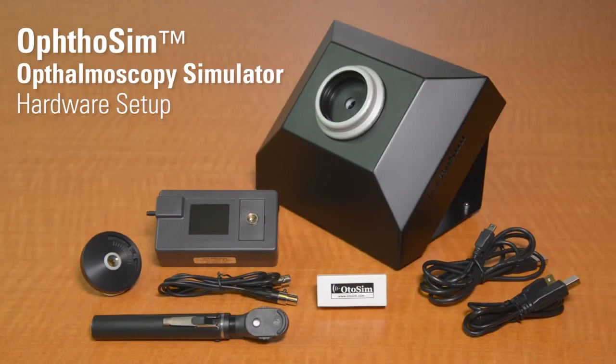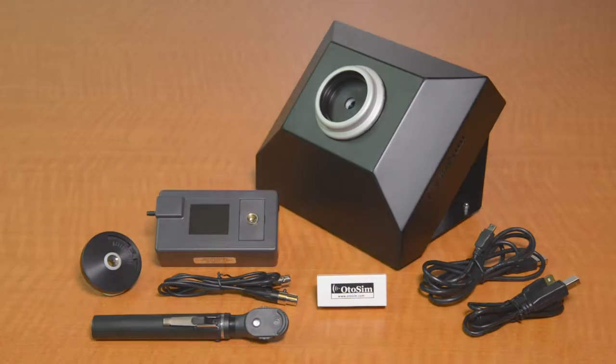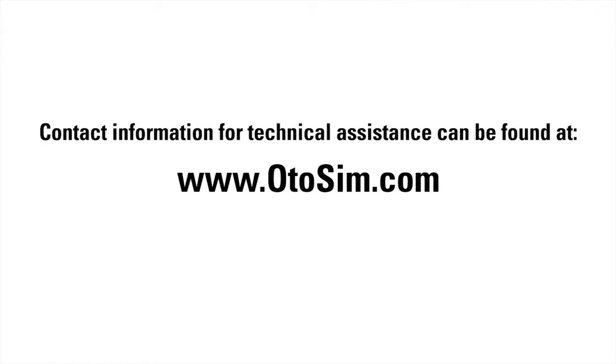This concludes the hardware setup for the ophthalmoscope simulator. If you need technical assistance, all contact information is available on our website at www.Otosim.com. One of our representatives will be happy to assist you.